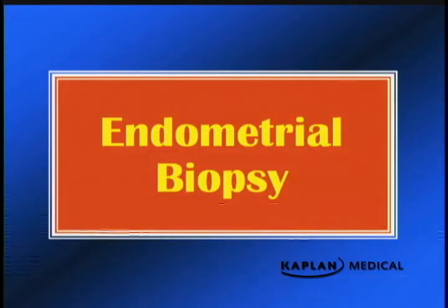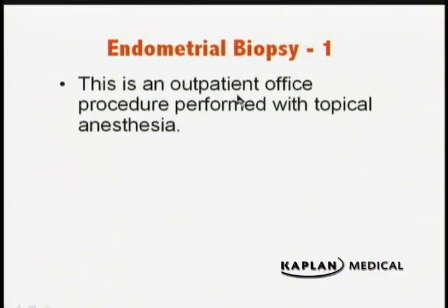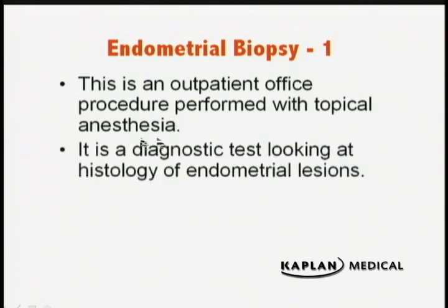Endometrial biopsy. This is an outpatient office procedure. And this is often performed either without anesthesia or with topical anesthesia placed on the cervix. It is a diagnostic test looking at the histology of endometrial lesions. The most common reason for this is postmenopausal bleeding. We'll talk about that later.